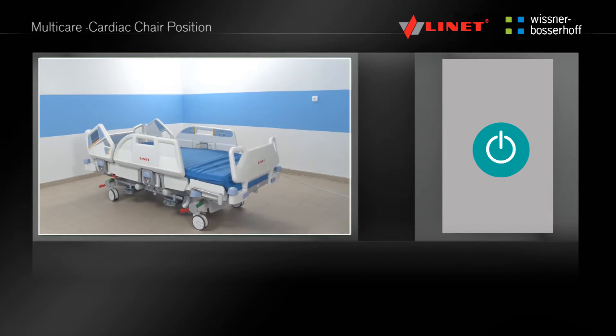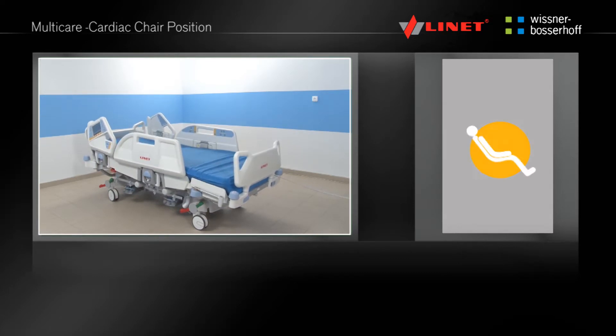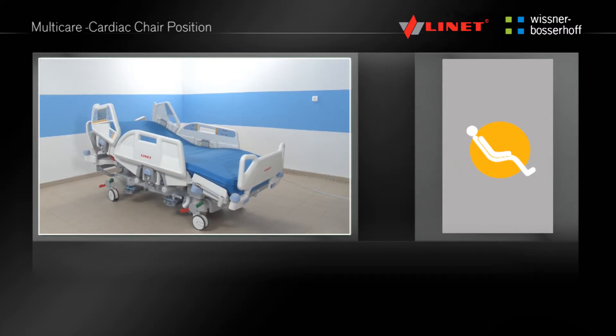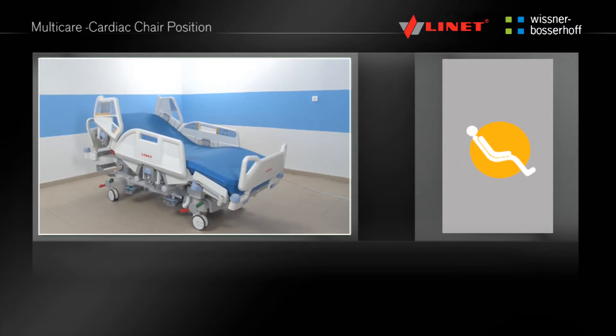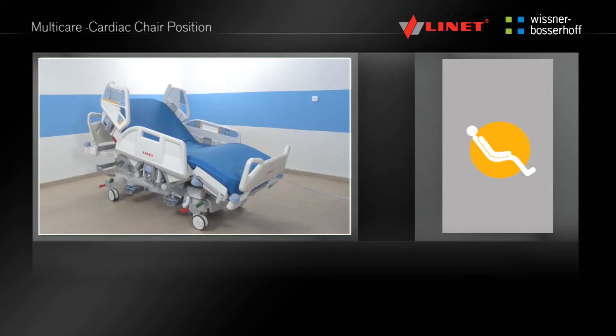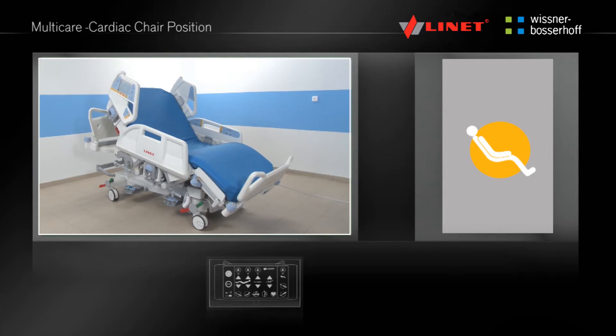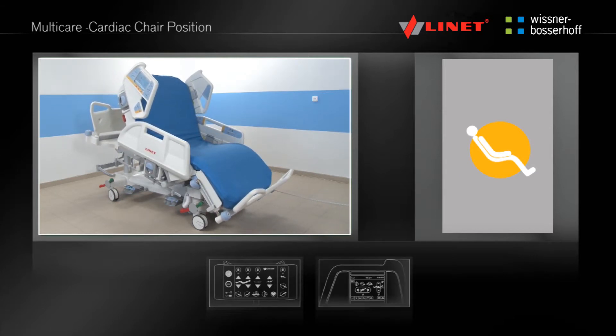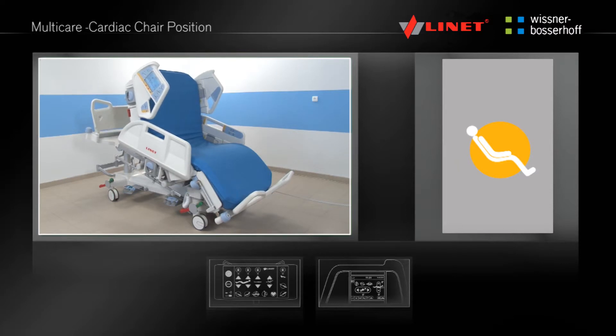Activate the function by pressing the Go button. Press and hold the pre-programmed function button until the cardiac chair position is reached. The backrest and thighrest are positioned to the maximum angle and the bed is tilted simultaneously as the foot end retracts. This function is only located on the integrated side rail controls and the Supervisor panel in the green area where the pre-programmed functions are located.